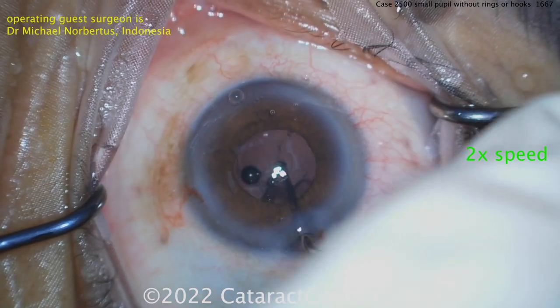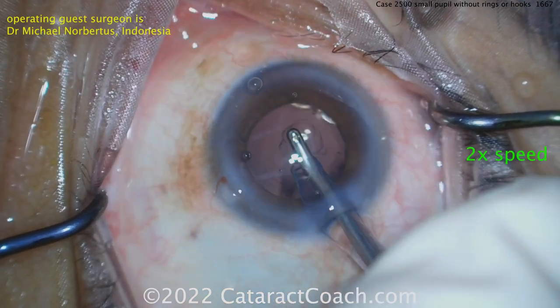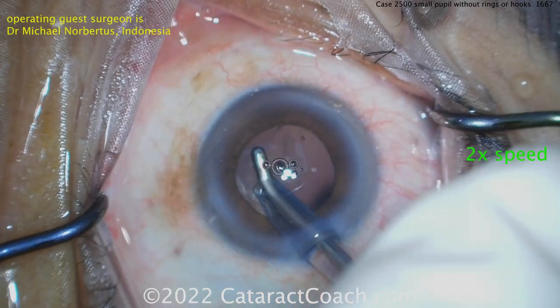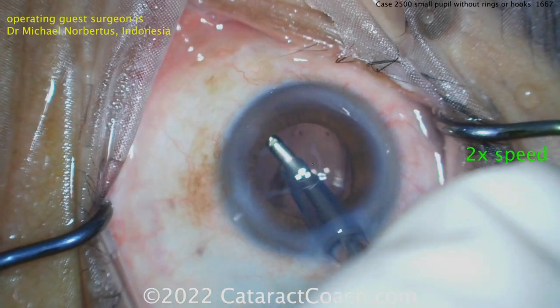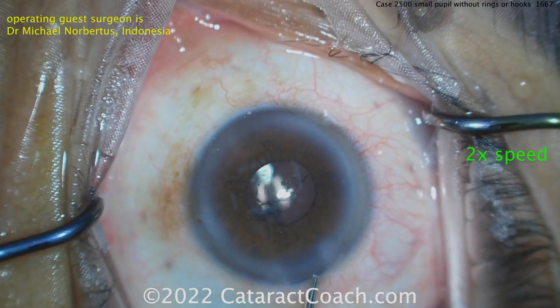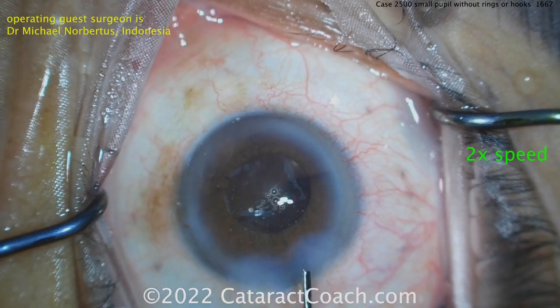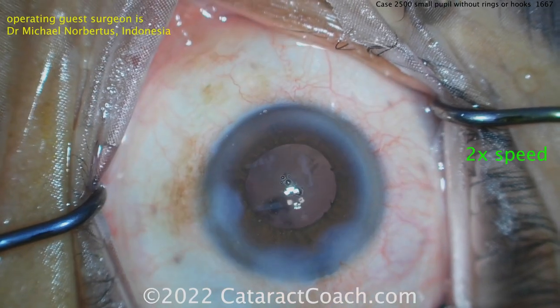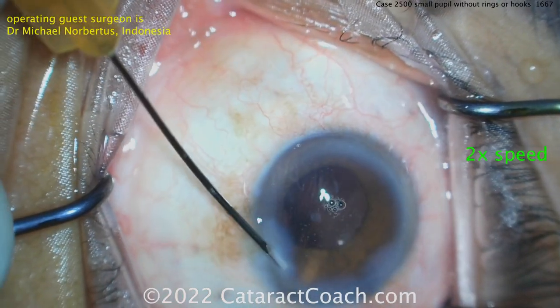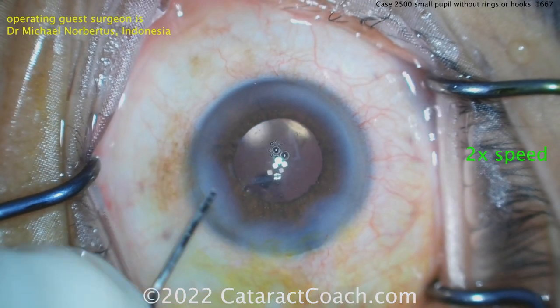At this point I like to lift up the iris with the chopper 360 just to get a good look around - hate to have a retained lens fragment. It has happened to all of us. Cleaning up all the viscoelastic, hydrate the incisions, call this a day. This patient's going to be thrilled. This was fun - it's like watching someone play video games at expert level. You young Jedis out there can achieve this too, keep up the good work.